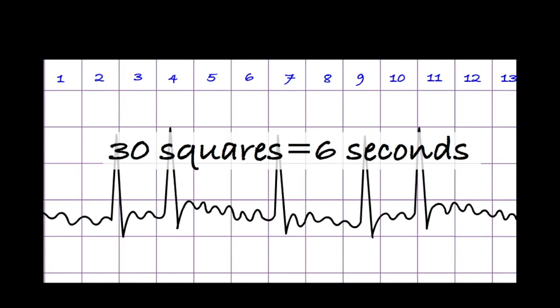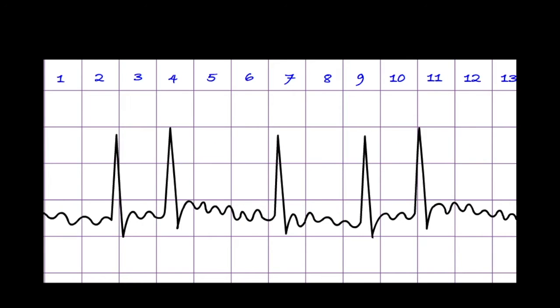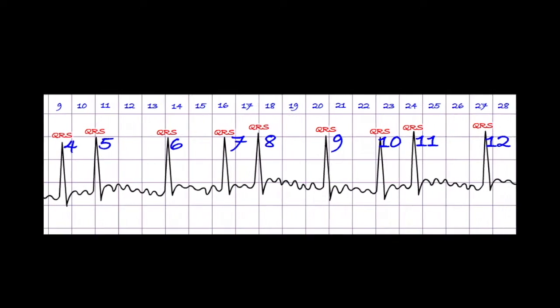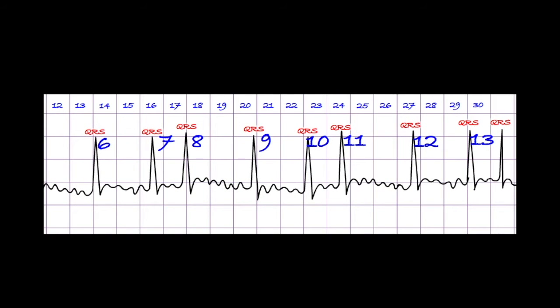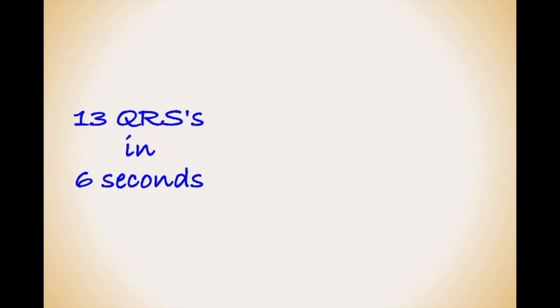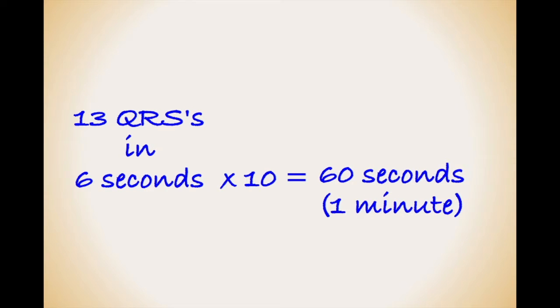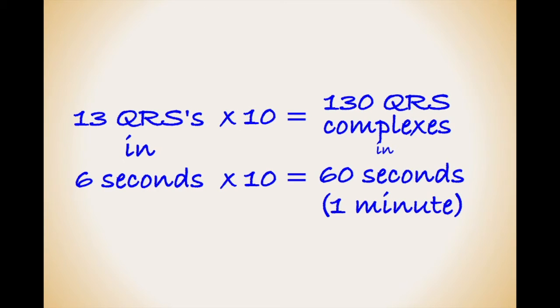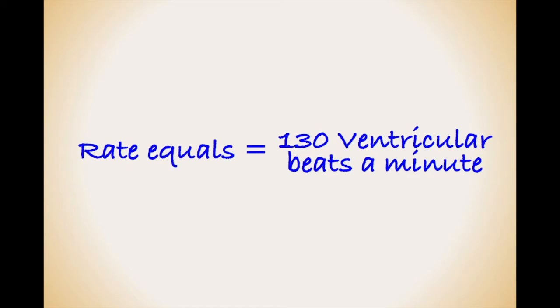I now want to count the number of times the heart beats within this 30 square, six second interval. As each QRS complex represents a contraction of the ventricles, counting the number of QRS complexes will allow me to calculate the ventricular rate. There are 13 QRS complexes within our 30 squares. If we times 13 by 10 we get our ventricular rate for the minute. In this ECG, the ventricles are contracting approximately 130 times per minute.